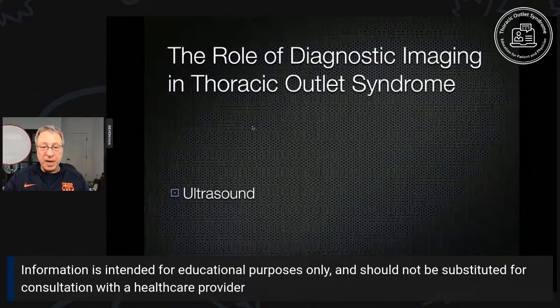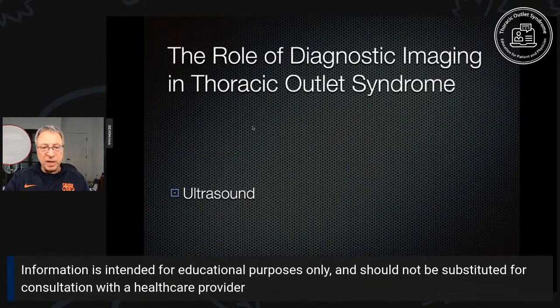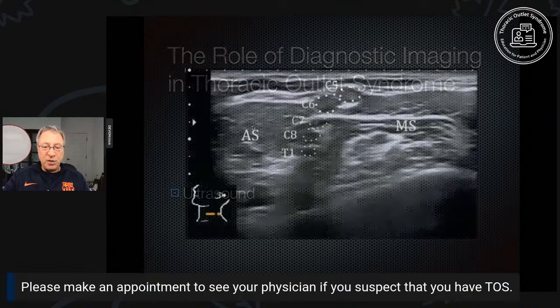Let's move on to ultrasound. Many of you may have had ultrasound. We know pregnant ladies get it. We know people with blood clots in their legs get it. Ultrasound is a pretty widely used test. It doesn't work with X-ray, so it doesn't provide radiation.